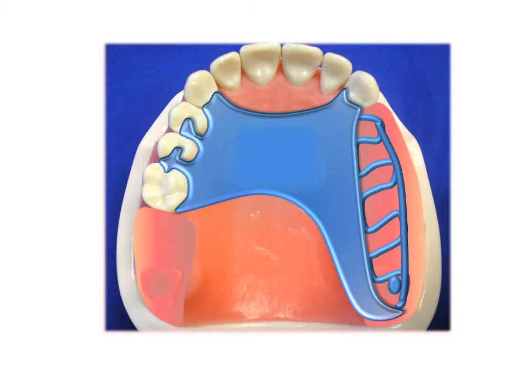Or use a modified T with 0.01 inch distal undercut. I prefer the modified T, because it resists rotational displacement of the partial denture, it is reasonably aesthetic, and the clasping adjacent to the edentulous space is inherently more efficient. Let's draw those clasps.